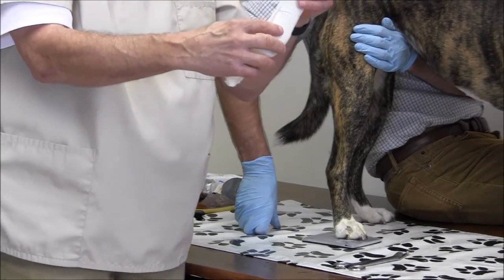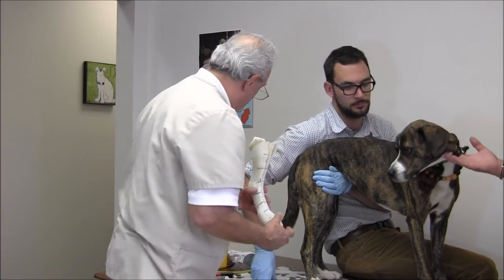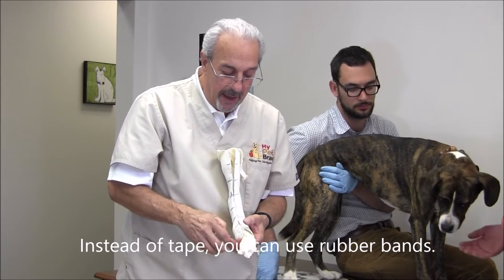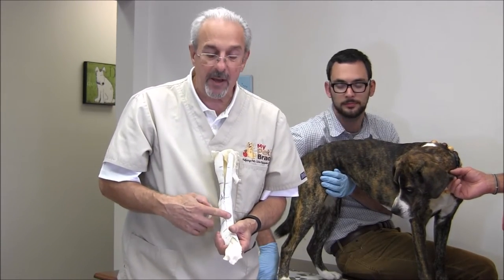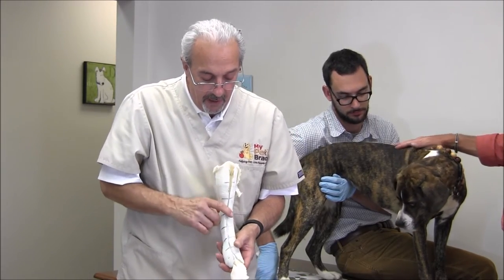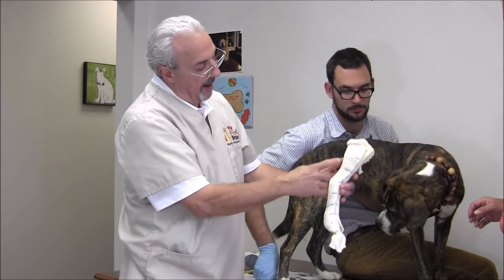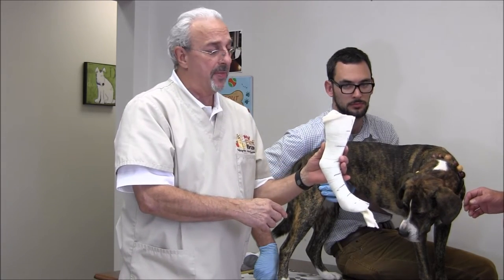Now it's still a little bit soft right now, but we can close it up. We'll take some tape and tape up the cast, aligning the marks we made across the cast to make sure it's in the right alignment. We want to make sure that the paw is at the correct angle, and the angle of the hock is the angle that we want the brace made in.